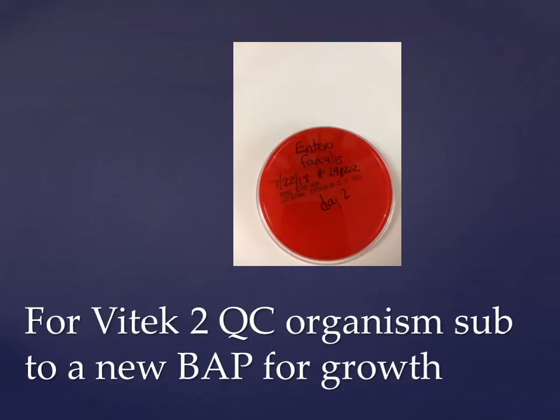So this is the second plate for the organism that we grew out. Like I mentioned earlier, we need to sub it a second day before we can put it on the Vitek 2.